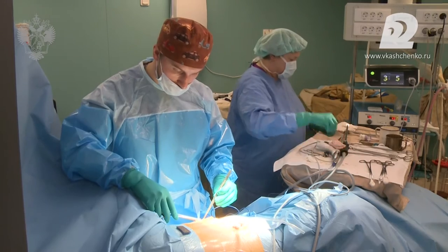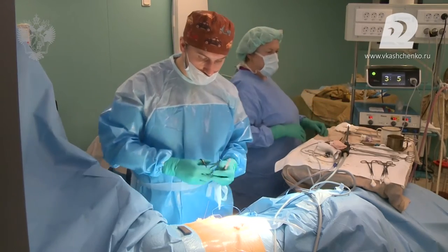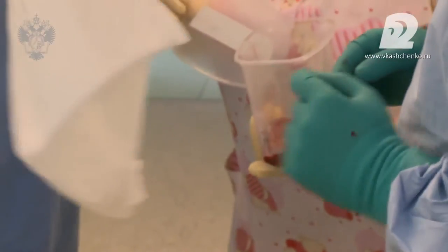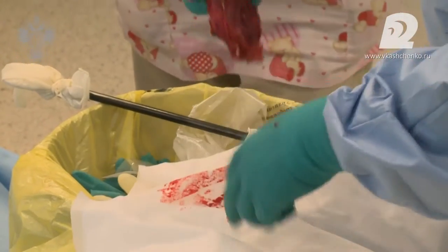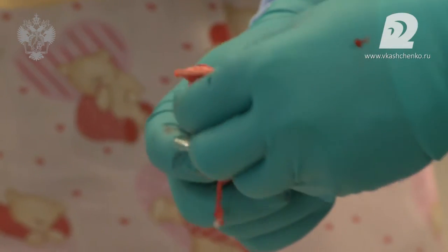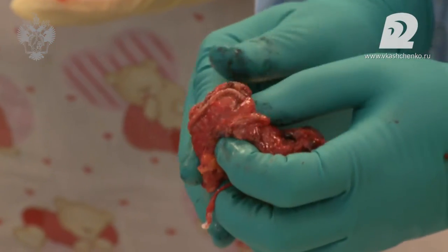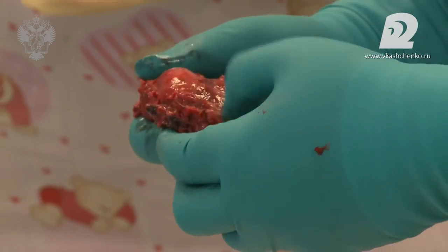We can actually show the specimen, the tumor specimen, if the colleagues want. Yes, of course they do. We have taken it to the jar via the port that we worked through. This is the specimen of the esophagus. You can see how massive and fleshy it is. This is the distal part of it. This is its proximal part, sutured. And it is all covered in lymph nodes and fibre.